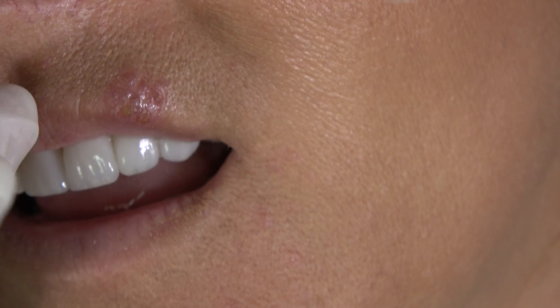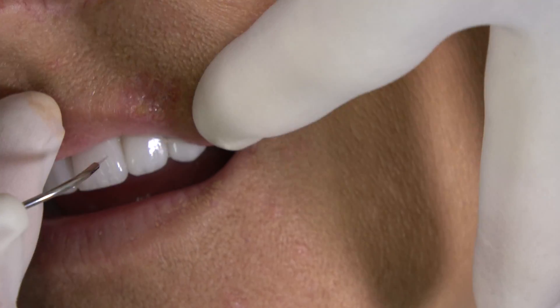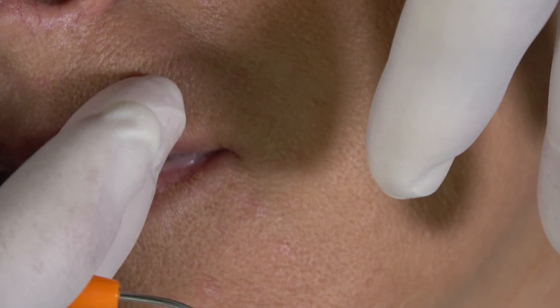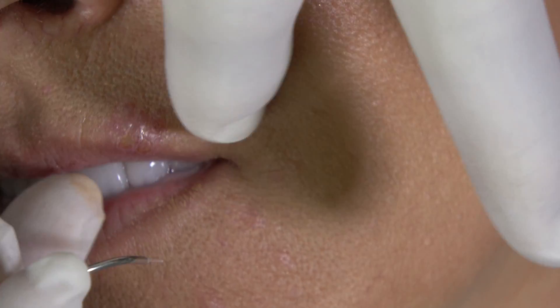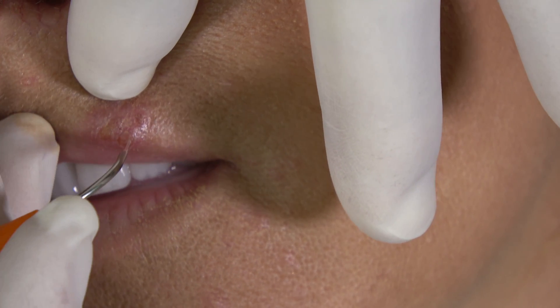All right, Erica, we're done. So it took us actually five different intervals. Before when I touched it, it was very, very painful — do you feel that at all now? No. Good. It's not going to instantly look better, but you're going to see it's going to heal much faster than it would in the past, and it's going to be much less sensitive for you.